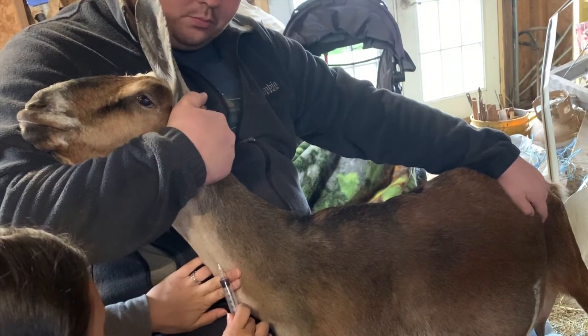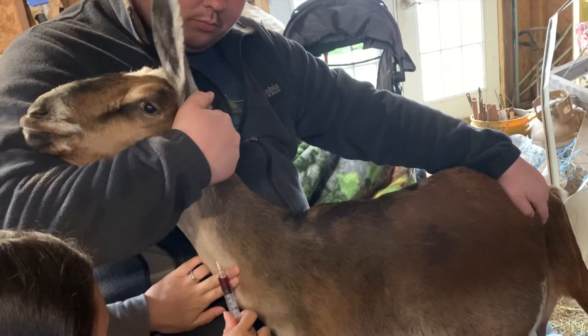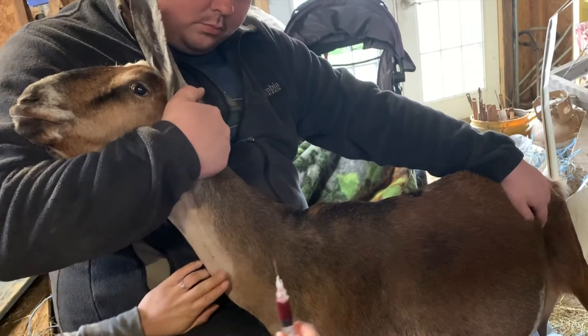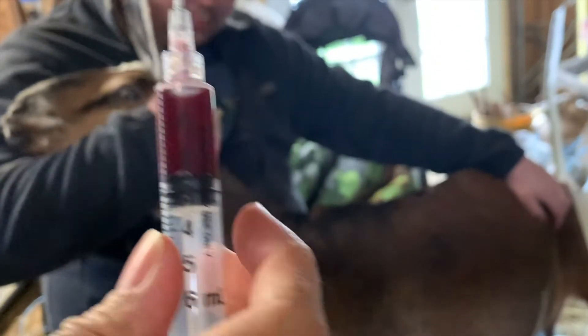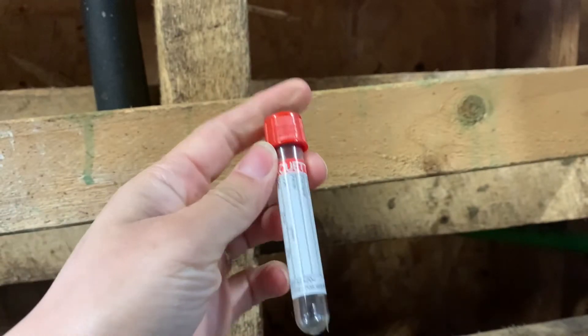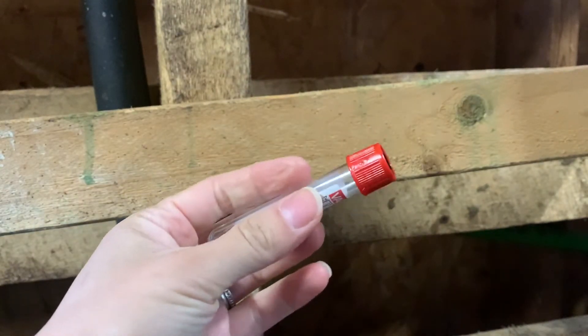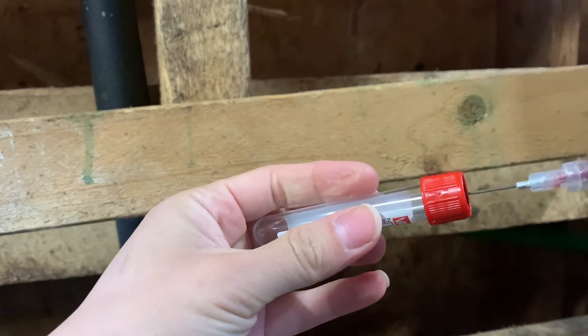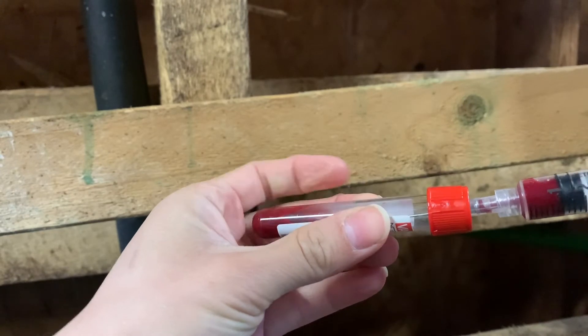Right there — I'm going to draw a little more than two cc's and that's it. This is our vacuette. You just push the needle into it and it's going to suck the blood right in there.